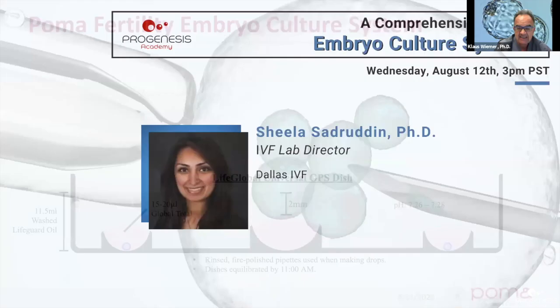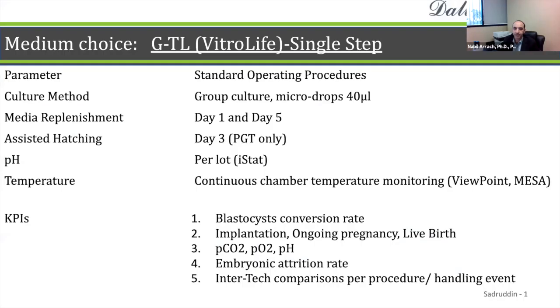Hello, everyone. I am the lab director at Dallas IVF. Of course, which media type to use is certainly something that all of the labs struggle with, because there are so many media out there. Here at Dallas IVF, we do use a single step media also. I do find that we get better results with that, and I'll show that with you in just a second.